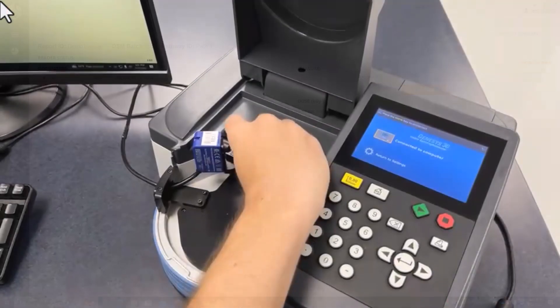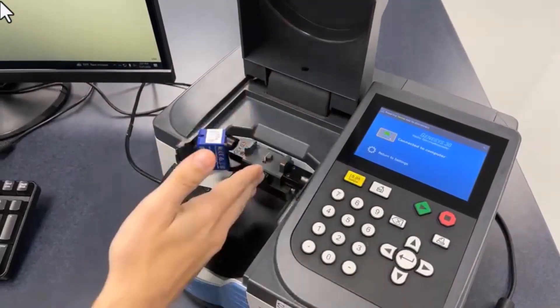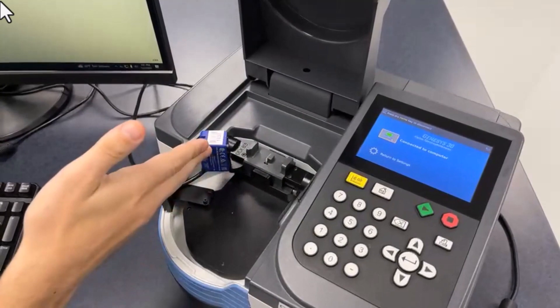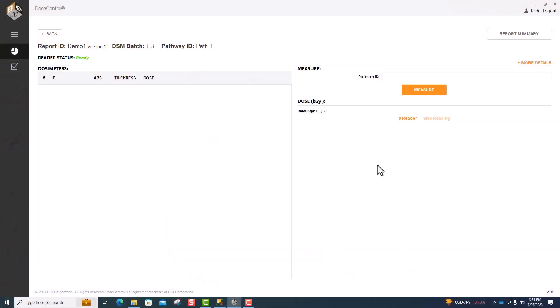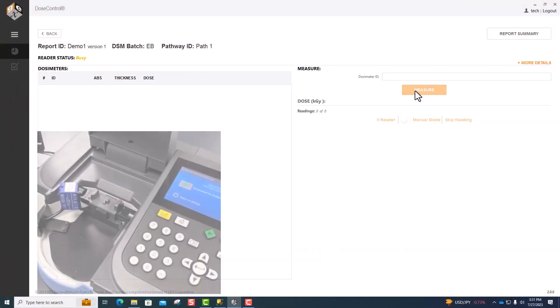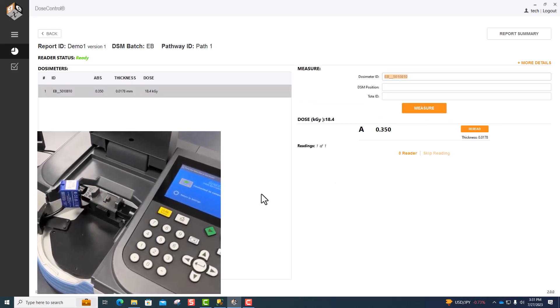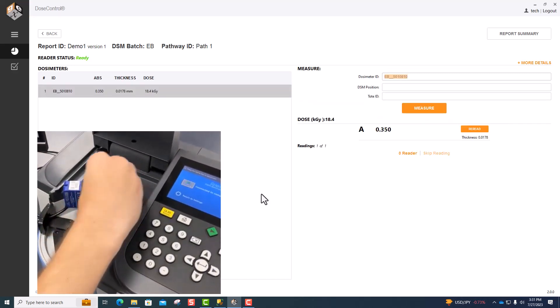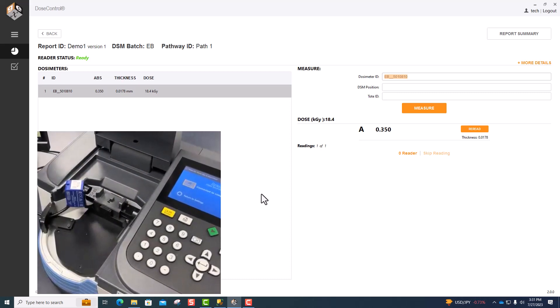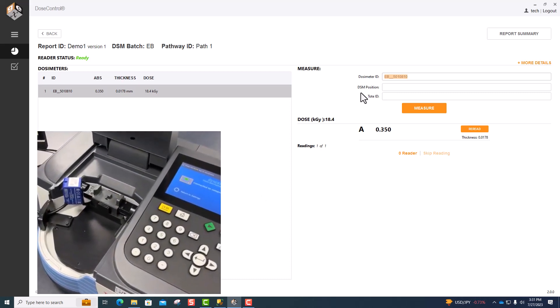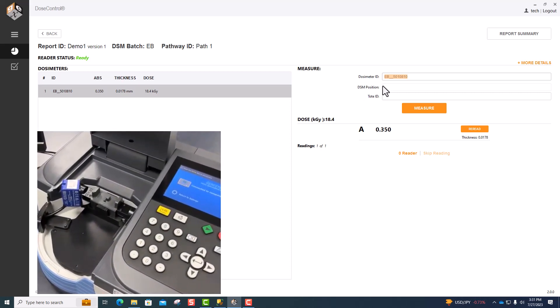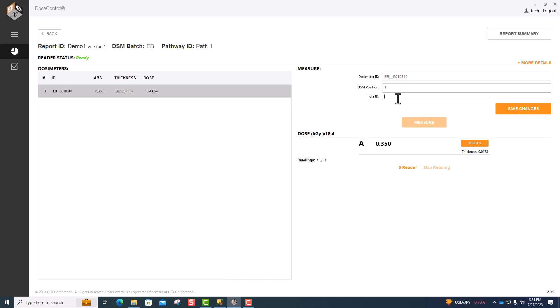Place the GB3 dosimeter into the holder with the barcode facing the matrix scanner and hit Measure in the software. When it's done, you can remove the dosimeter, and there are fields for the dosimeter position and tote ID. When those have been entered, hit Save Changes.